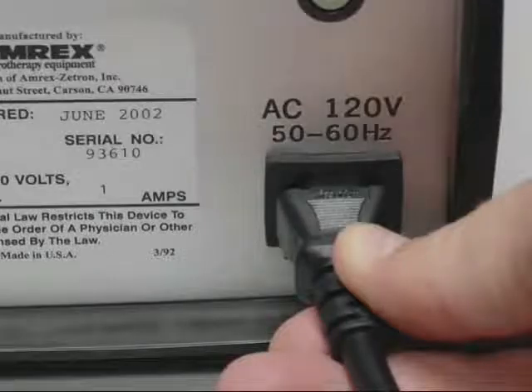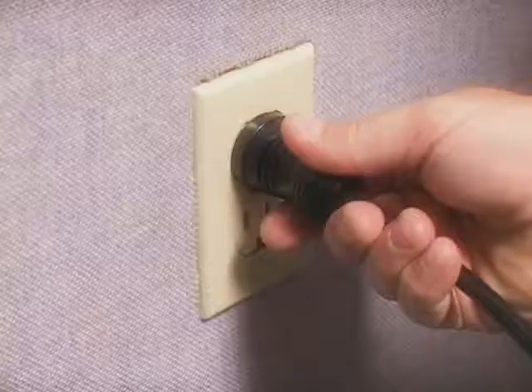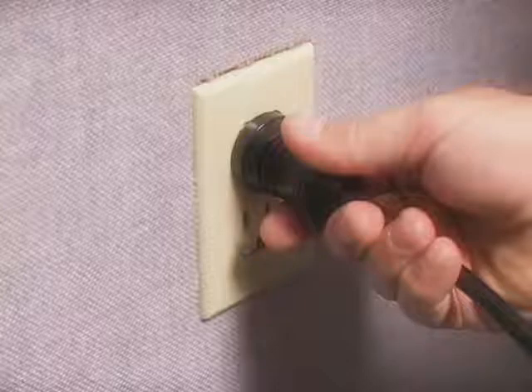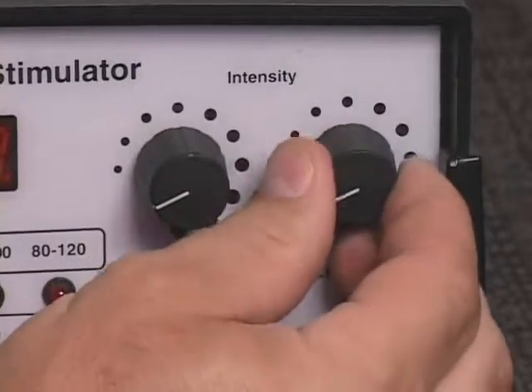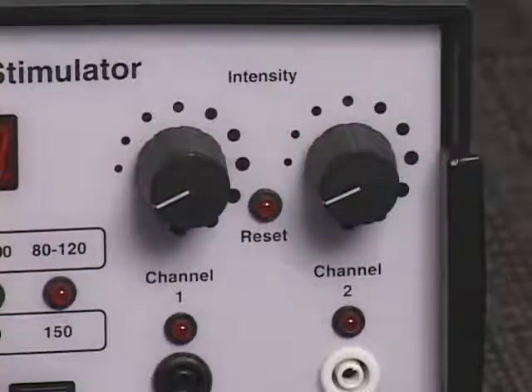In order to operate the IF-150, you must first connect the power cord to the AC receptacle on the back of the unit and insert the power cord plug into a properly grounded AC receptacle. Reduce the intensity controls to the zero reset positions, enabling the audible clicks.